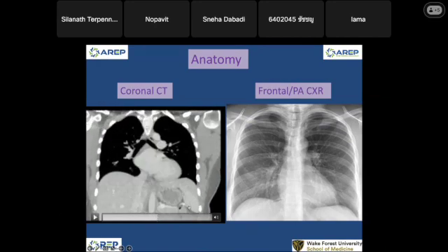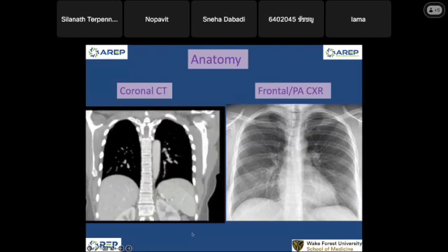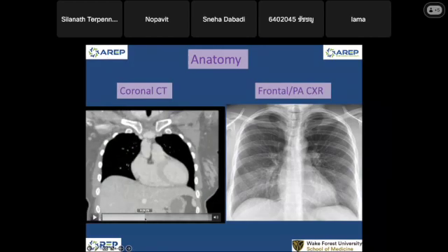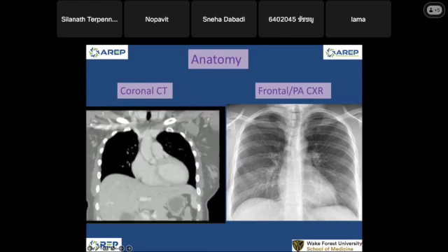Okay, this is my spleen right here. And this is the stomach with the fluid. And we also have a little bit of the left kidney and right kidney. You can see it here. This is my right kidney and left kidney. We can't see those structures on the chest radiograph because it all blends together. And I think we see, let me look at this.